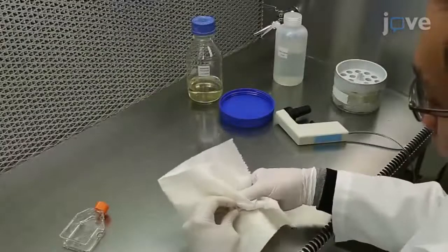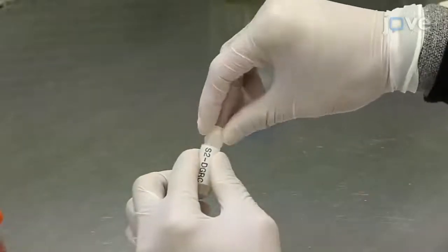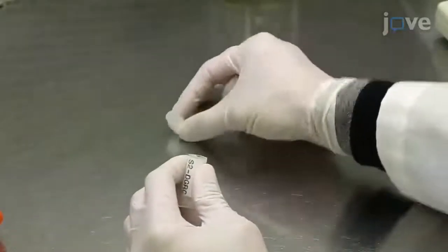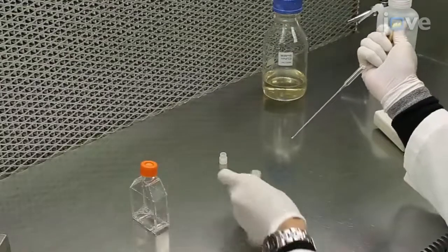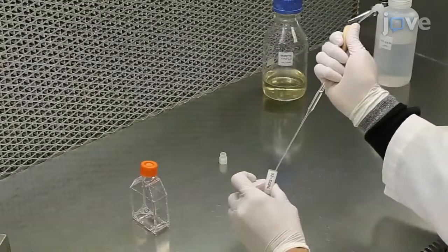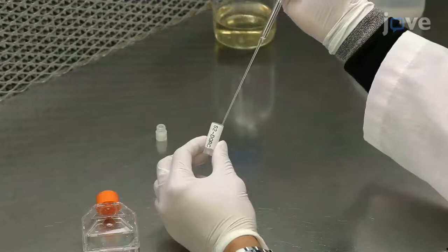Wipe the container of frozen cell line with 70% ethanol and carefully loosen and unseal the lid. Using a Pasteur pipette, transfer 1 mL of room temperature medium from the flask to the cryovial and gently mix to thaw the frozen cells, taking care that the cell suspension does not overflow.